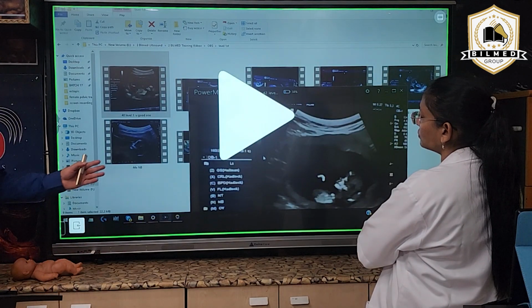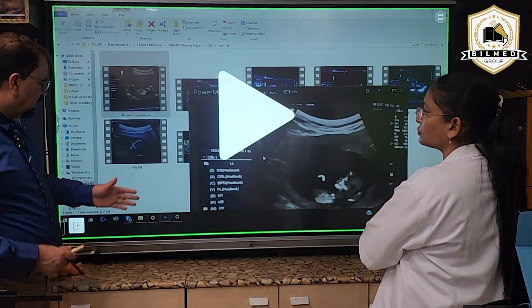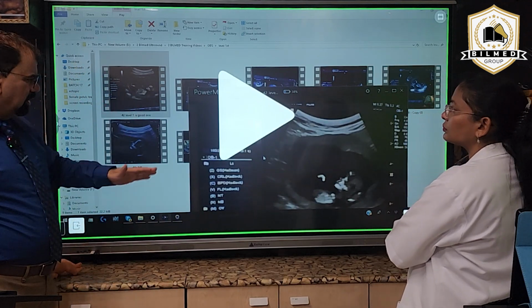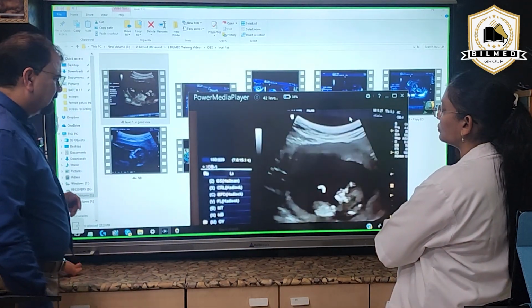So over to you for presenting the live cases of this DV, of this level 1 as a whole. So these are some cases where we are taking this DV.